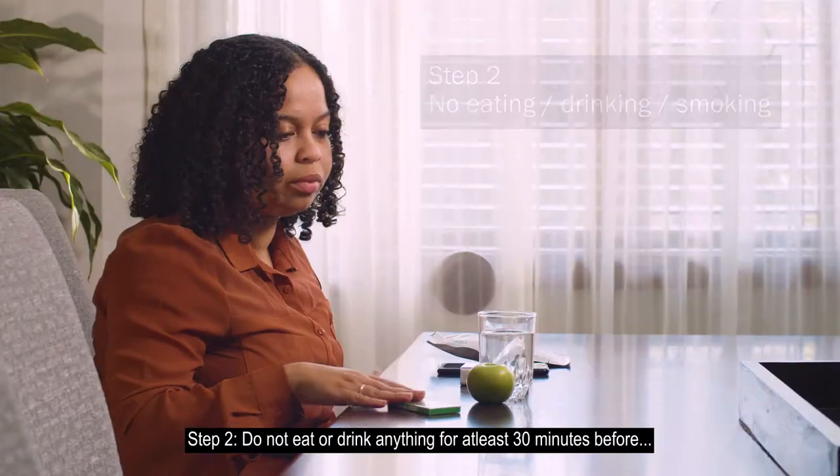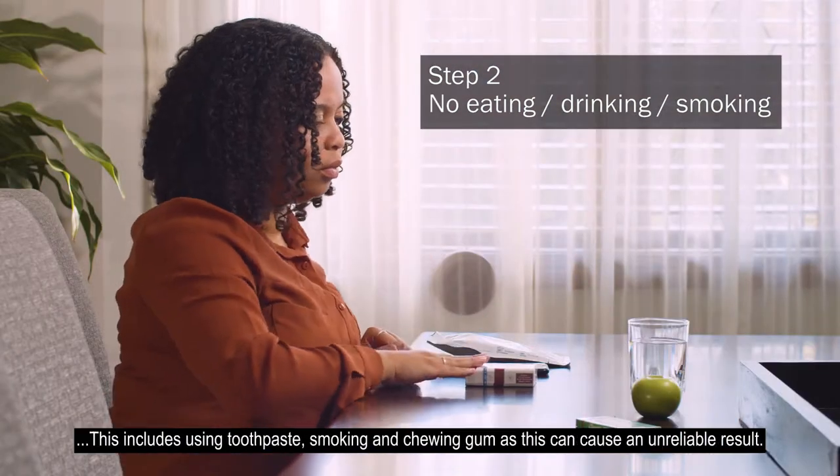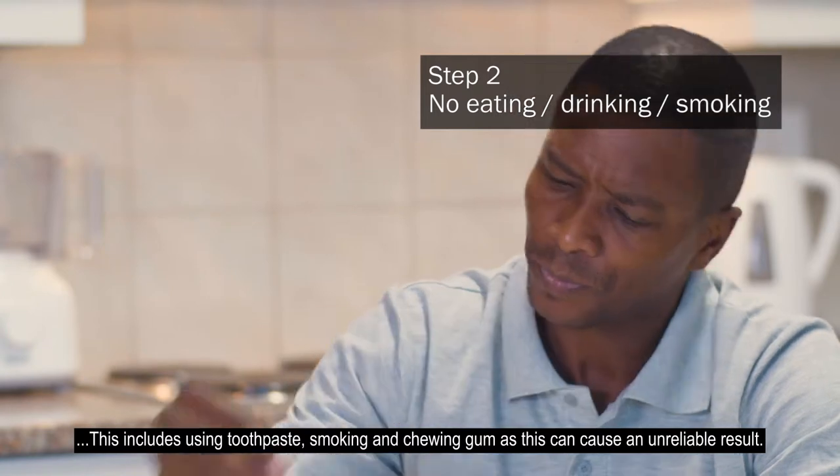Step 2: Do not eat or drink anything for at least 30 minutes before. This includes using toothpaste, smoking, and chewing gum, as this can cause an unreliable result.